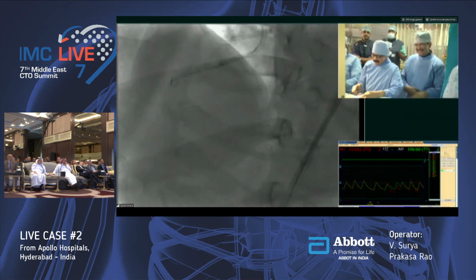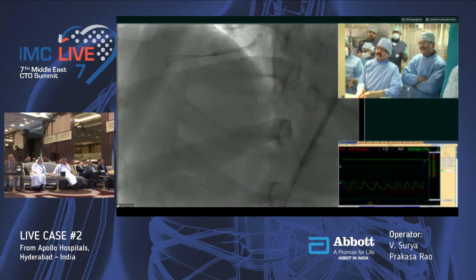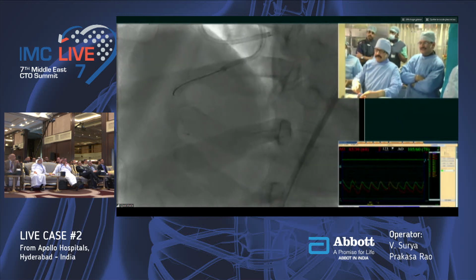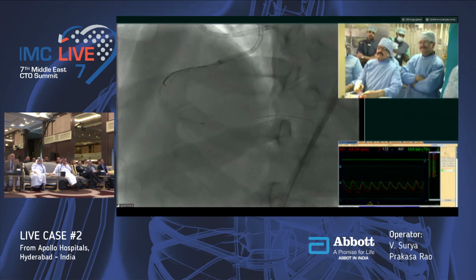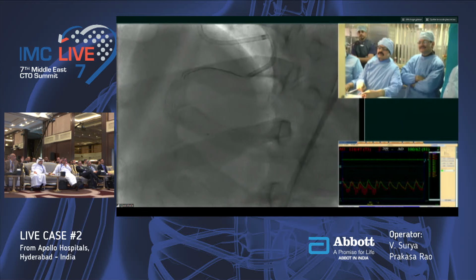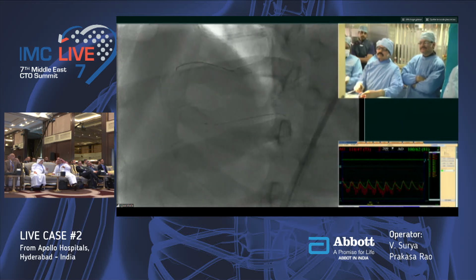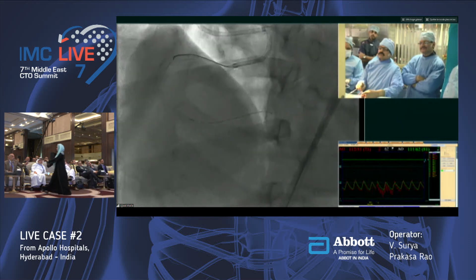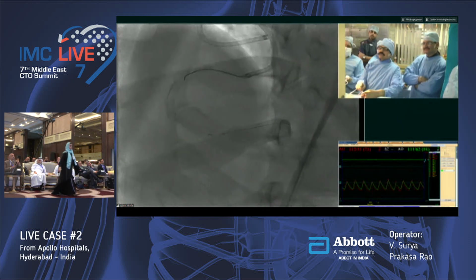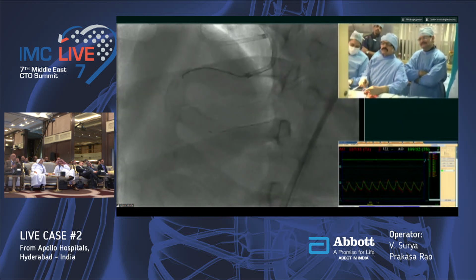Which one? So this is the same balloon? No. This is Sapphire 1 millimeter, lowest profile. Okay, so Sapphire 1 millimeter. Yeah. 1 millimeter. Difficult to cross. But just inflate the balloon a little bit. So be careful of your guide. Another technique we use: we keep it inflated at 3-4 atmospheres, then I'll push the balloon. Sometimes that will work out.